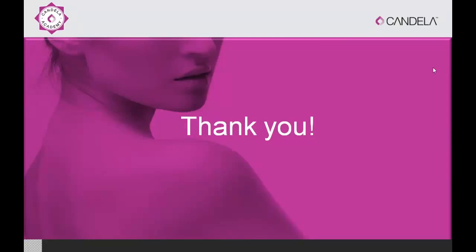What is the maximum number of passes? I wouldn't exceed 4 passes with the Resolve handpiece, and with the large zoom handpiece, I also wouldn't exceed more than 4 passes. With another device, there was a good study showing that more passes than the recommended ones did not show any superior efficacy.